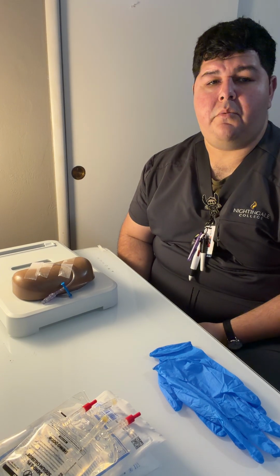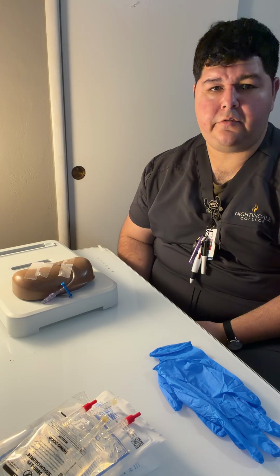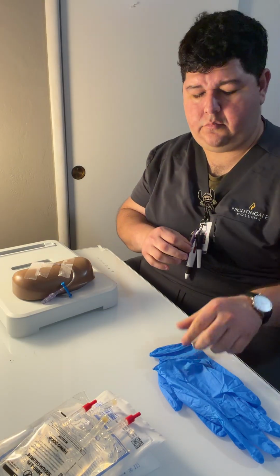Hello, my name is Jose Miranda Velasquez, and I'm going to demonstrate the IV fluid and medication administration video for BSN 266. I'm going to start by performing hand hygiene, donning my gloves.